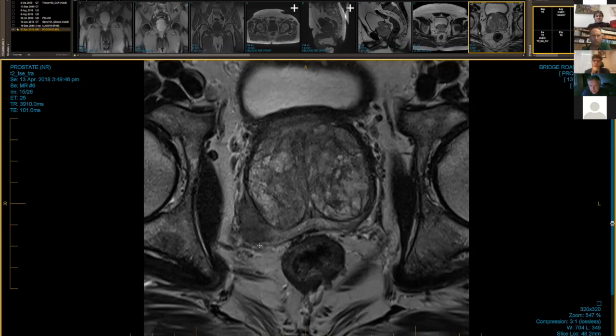Yep. That would be 90% or under 1.5 millimeters. The other thing I'd say about PSA recurrence: the early recurrence, like in this patient, is likely to be lymph nodes or bones. But in the patient who recurs a couple of years down the track, a local recurrence kind of picture, MR is much better than PET.